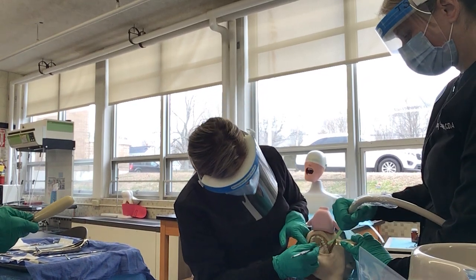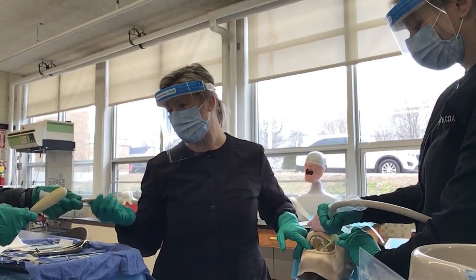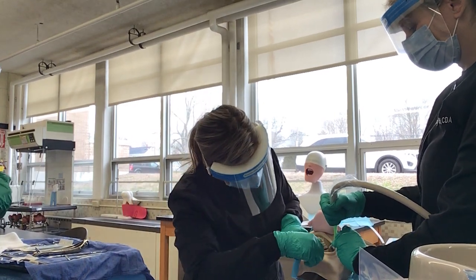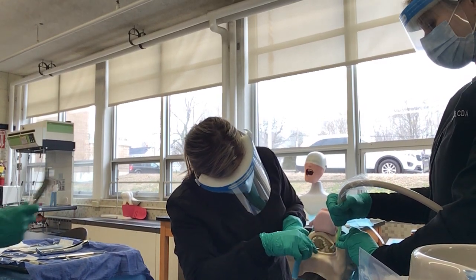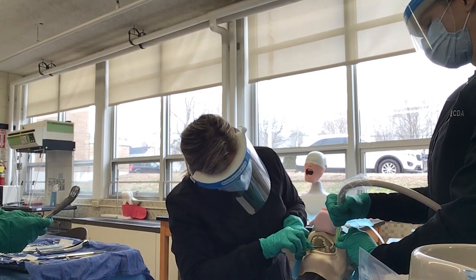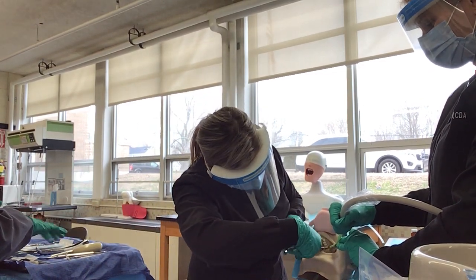So I'm using that periosteal elevator to move that periosteum away from the bone. Now she's going to pass me the straight elevator, and I'm going to put some pressure on that tooth to help loosen the tooth from the socket. And then she's going to pass me the universal maxillary forceps. I'm going to put a forceps on there.